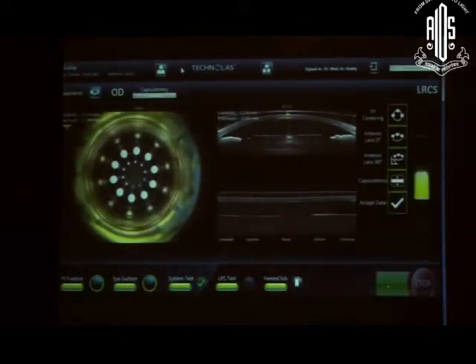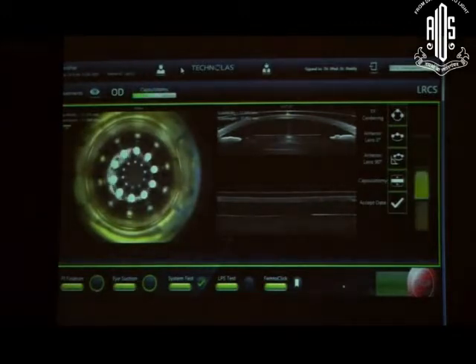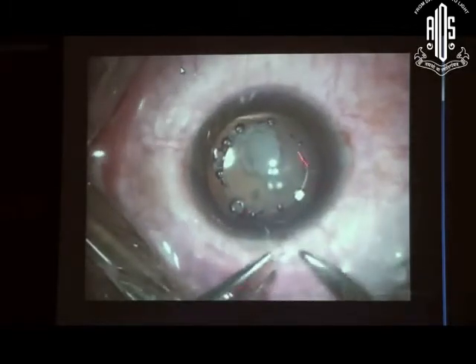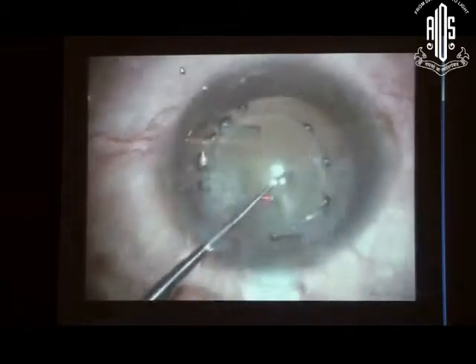The only thing here is that when the ablation is coming from the posterior aspect of the anterior capsule, it goes a little bit into the lens itself. So this is another area we're going to face a lot of in future, because a lot of us are using a lot of ICLs, and today in India, some companies like IOCare are also making these posterior chamber lenses. So here is the video part of it, and you can see that nice, beautiful capsulotomy behind the ICL.